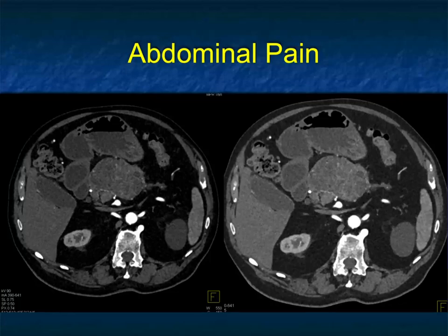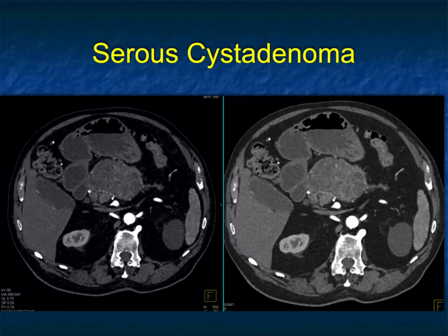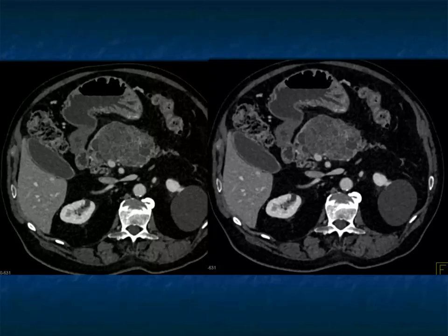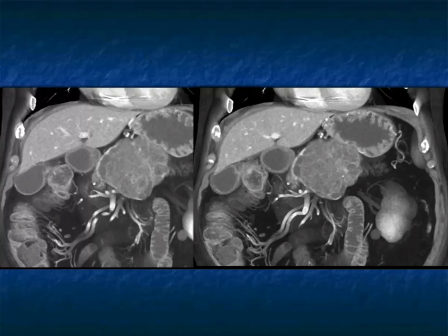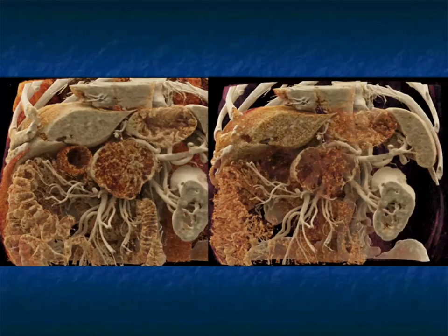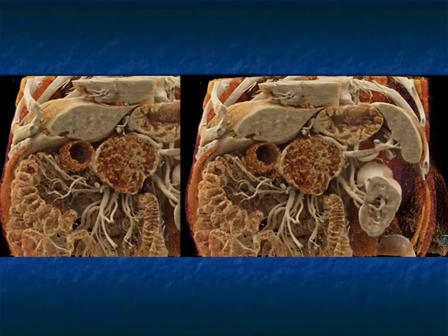Another patient with abdominal pain: a cystic lesion in the body of the pancreas with very impressive atrophy of the distal gland. As you look at the venous phase imaging and stare at the lesion more, you recognize the multiple septations and cystic components, particularly nicely shown on volume rendered coronal views and really nicely shown on the cinematic rendering. Just a really nice example of accentuating the variable changes that allow you to be more specific in calling this a serous cystadenoma.